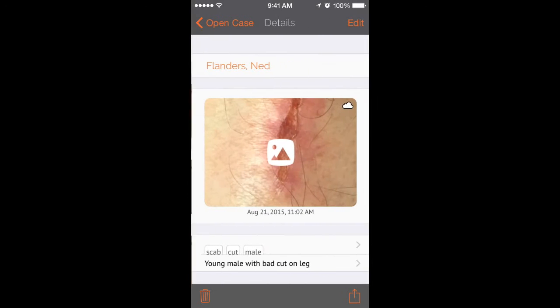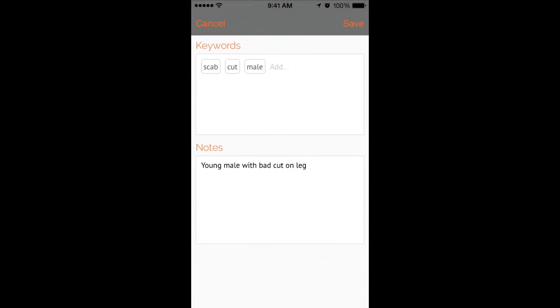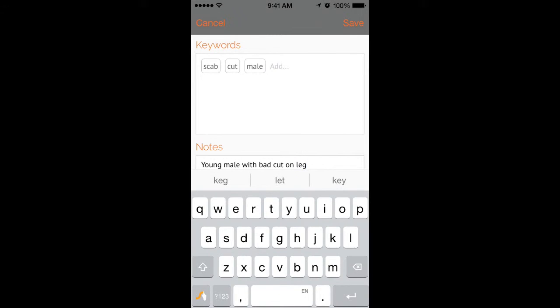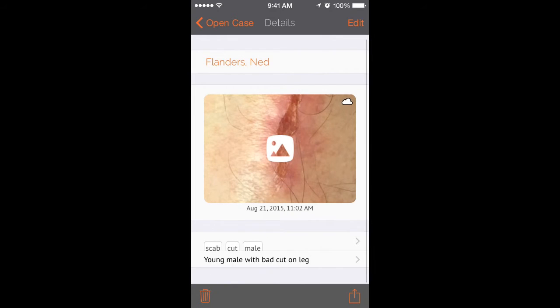So if I click on my image, I can then edit on the bottom the keywords and the notes that have been added to this image. Then by clicking save, I can return back to my image.